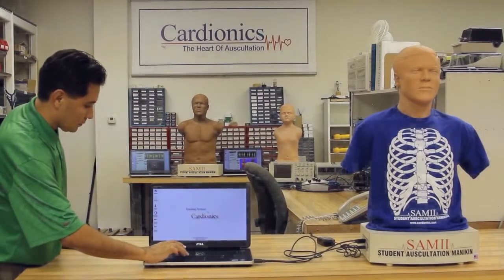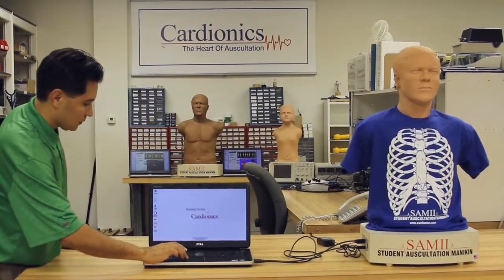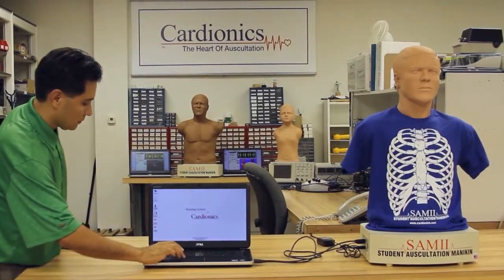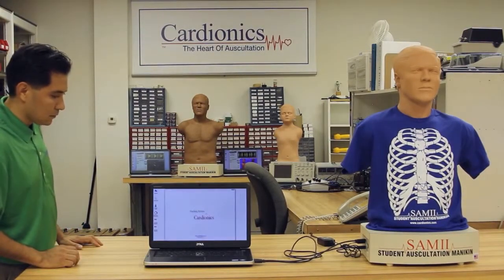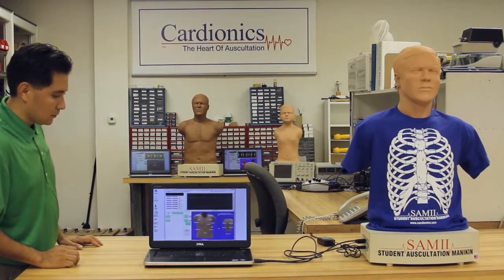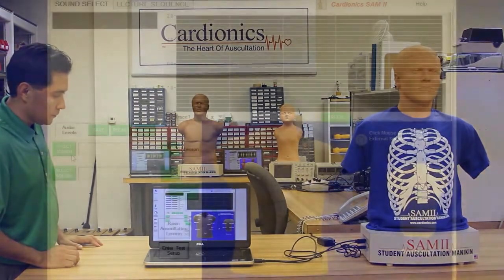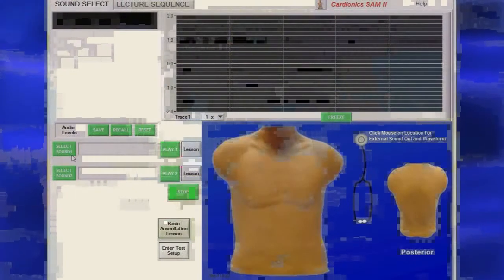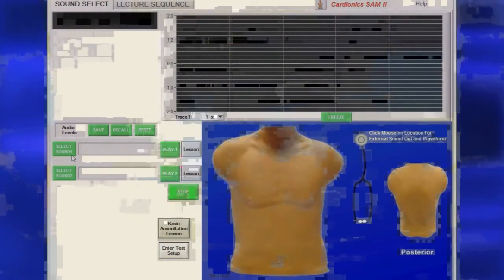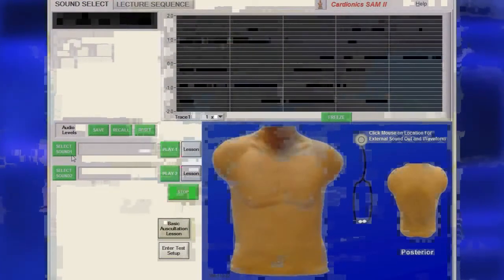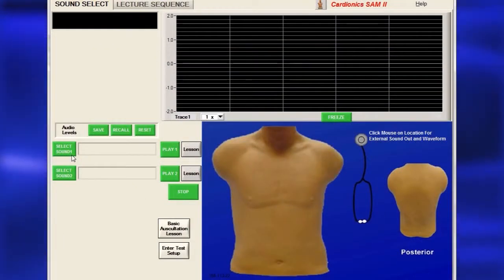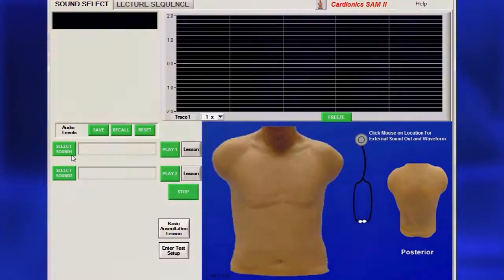To access the SAM2 software control interface, double-click the Cardionics SAM2 icon on the main desktop. SAM2 software has two main sections: Sound Select and Lecture Sequence.